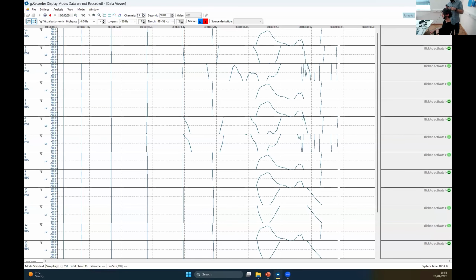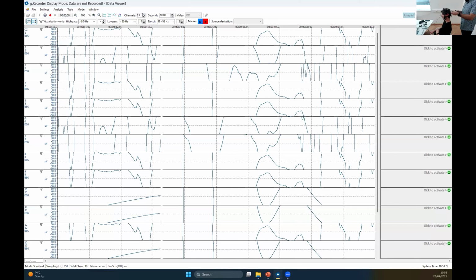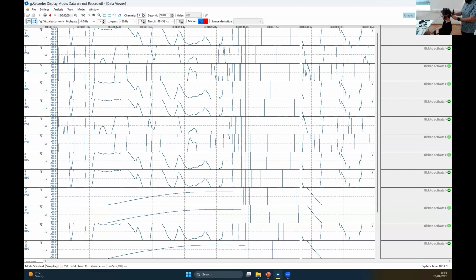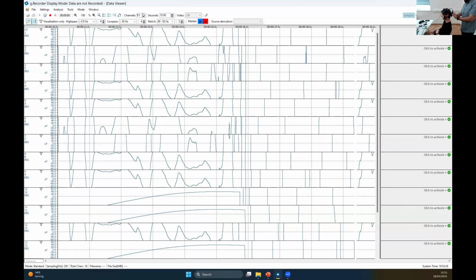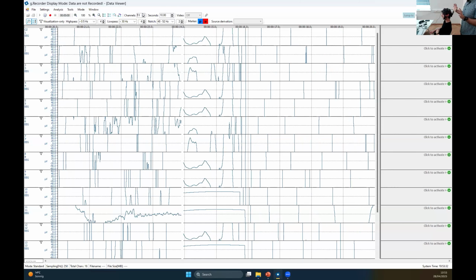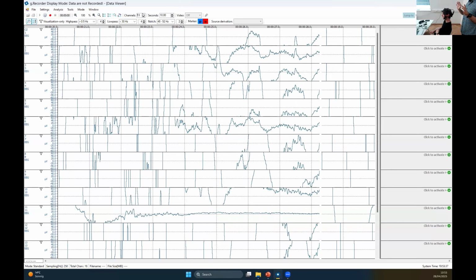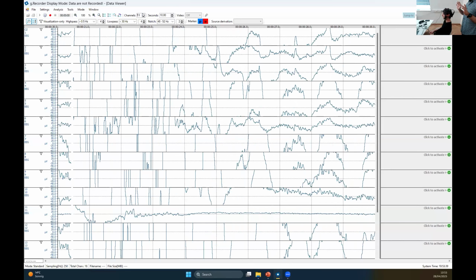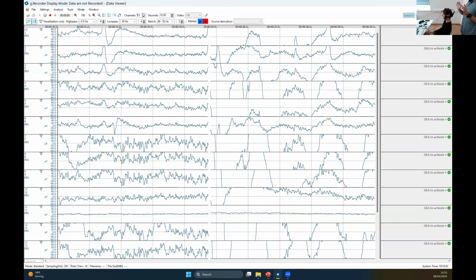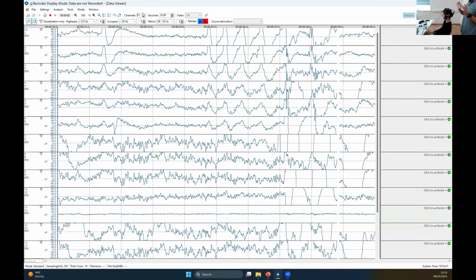And good. We have here the device connected. And we have the connector here. And we can connect the device, put it into Matthias' cap. And that's basically it. Now we wait a bit to see the EEG signal there. Can already see something. Very good. Matthias, can you blink? Can you bite? I can see the bites.